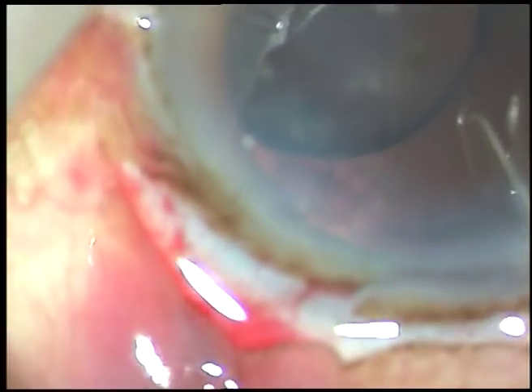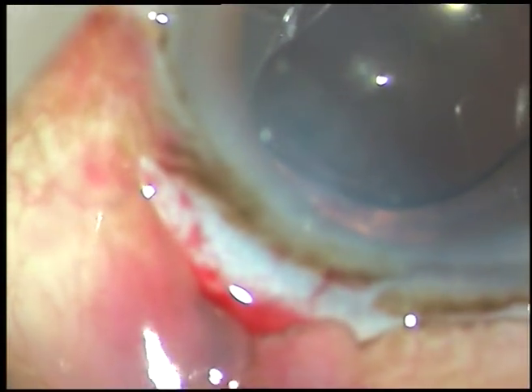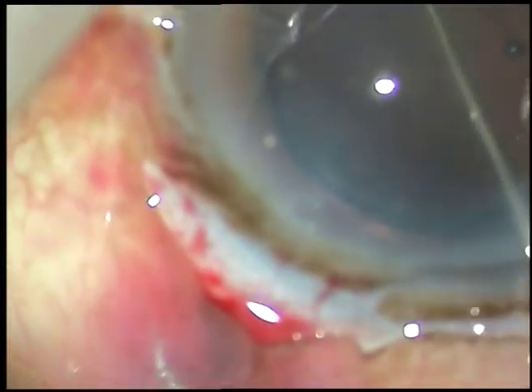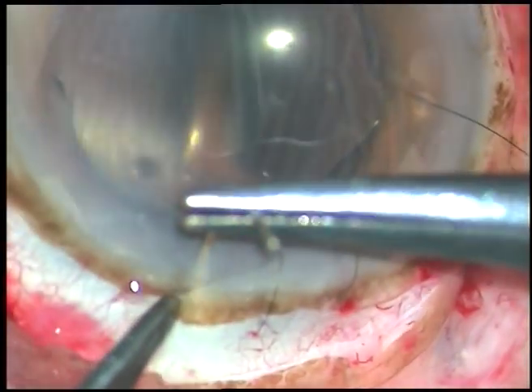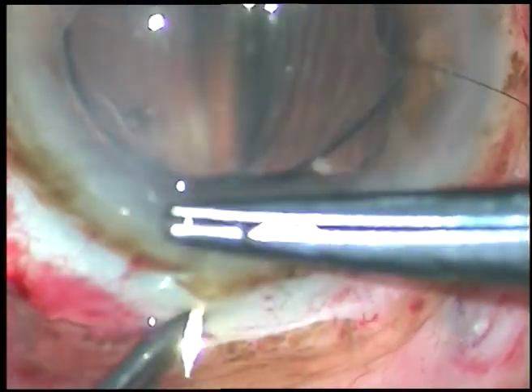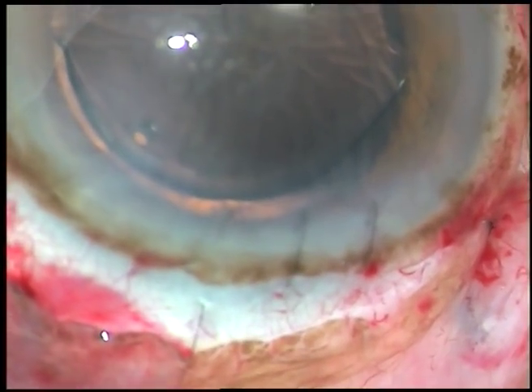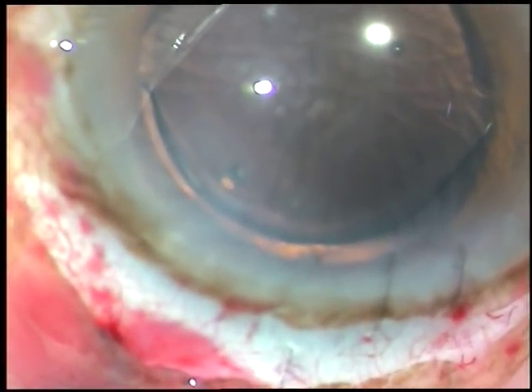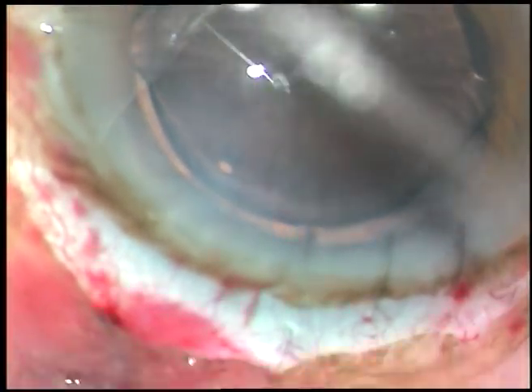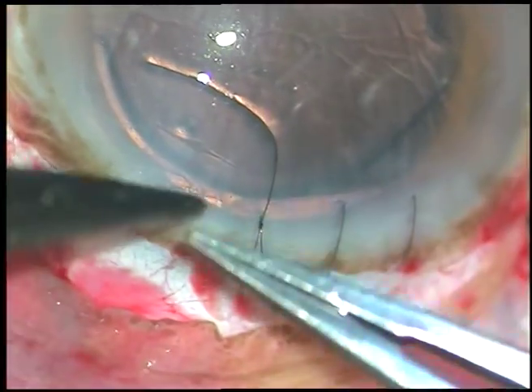And now I pull the other haptic and place it, center the lens over the anterior capsular rim, and it's a nicely centered lens. And now I put some sutures, 3 sutures required to close the limbal incision.